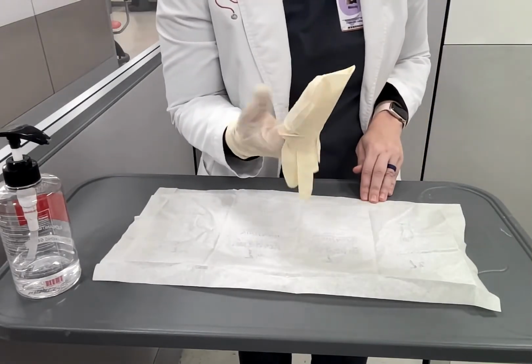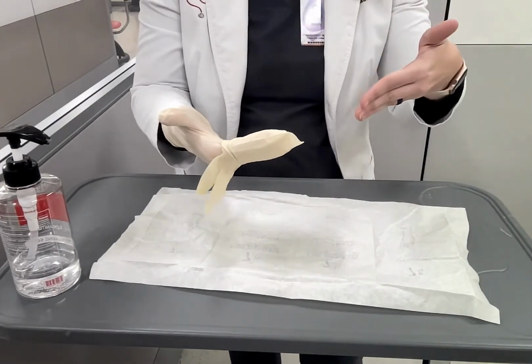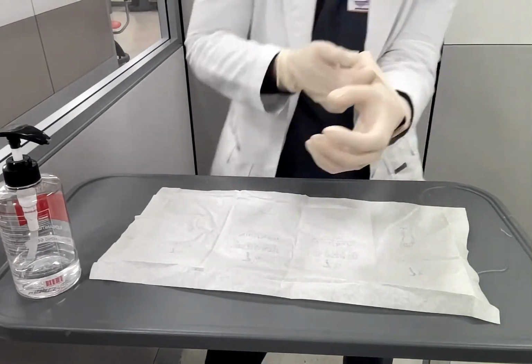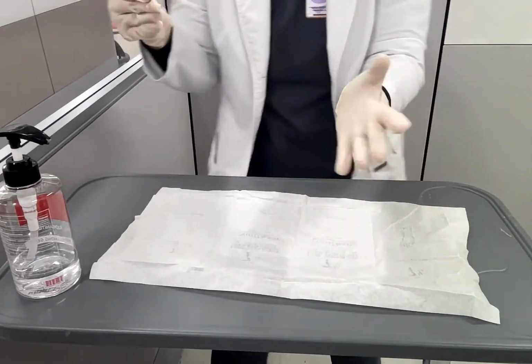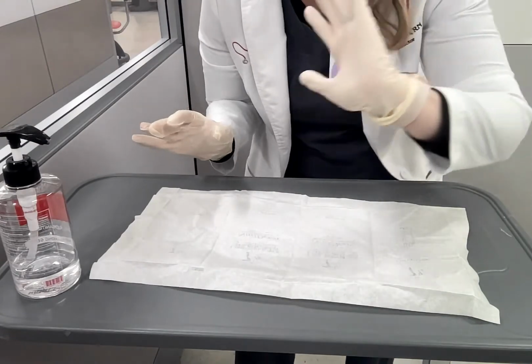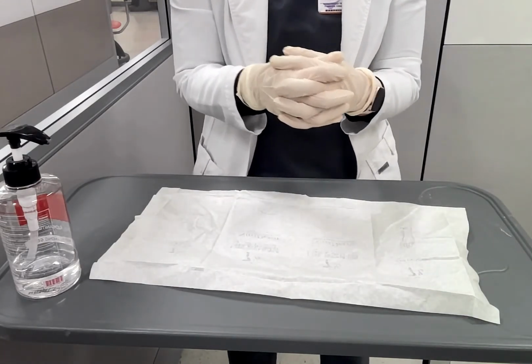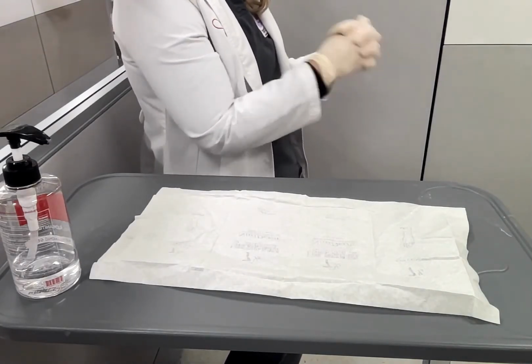So you've scooped it on. You may have used your thumb to hold it, and now you're gonna flag out your thumb. This hand is gonna go in. You notice that it stays cuffed. I have great grip. I'm pulling down. Then I slide it out. I don't fuss with the cuff now. Let it be what it's doing, which is semi cuffed on itself. And there we go. I put my hands interlocked above my waist to show that I'm ready. I do not pull it in towards my chest because now it's touching unsterile. This is sterile, this is not.